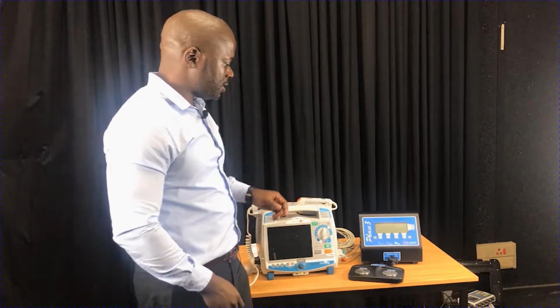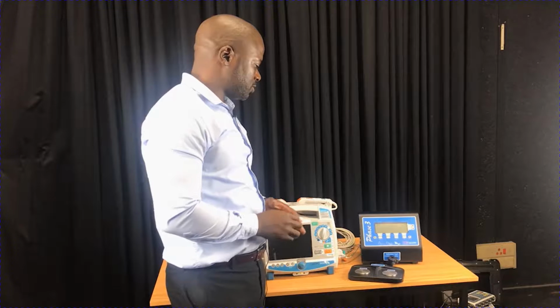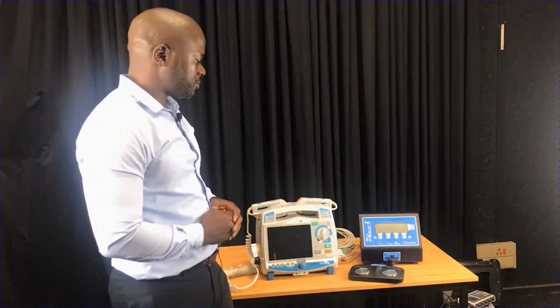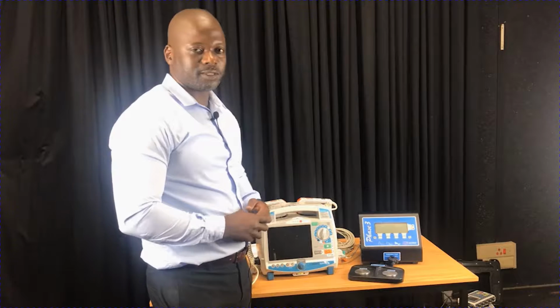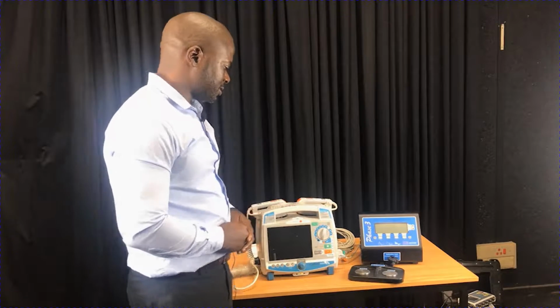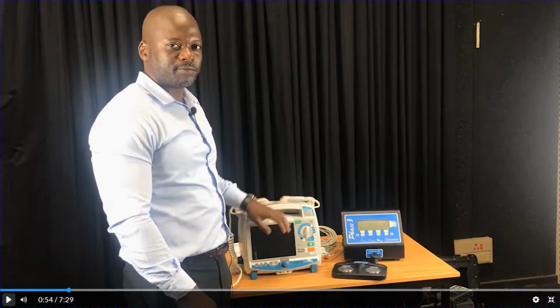And the next step, we will be doing what you call your IPM, which is your inspection and preventative maintenance. We're going to go through a couple of steps, starting with your qualitative test and quantitative test. So there's a checklist we're going to go through that will help us to test this. So basically, we're just going to do a practical demo.